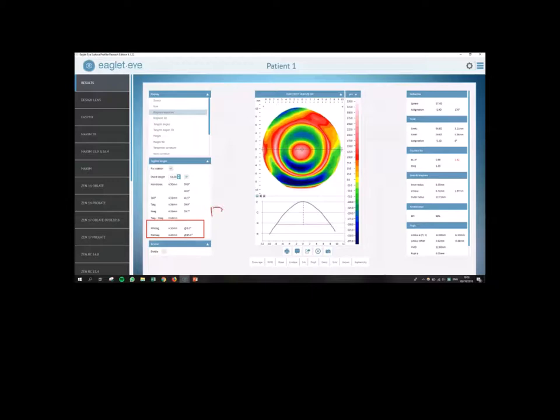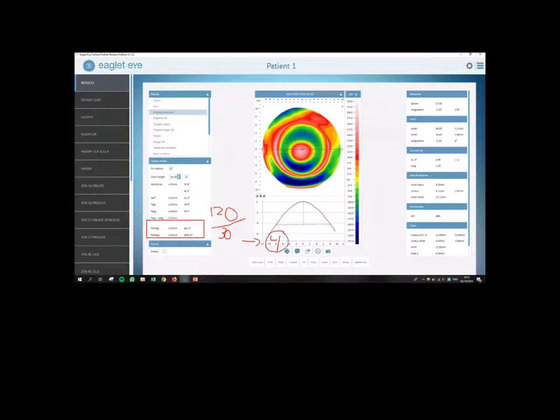In the case of a Zenlens, we do suggest toricity. So there's a 120 microns difference. Each Zenlens APS tab is a value of about 30 microns. So if we divide that through each other, we would think about four steps, four steps in toric APS, which is what the algorithm was suggesting. So now if I go back to the Zenlens prolate, I can see there's four steps of toricity in here.